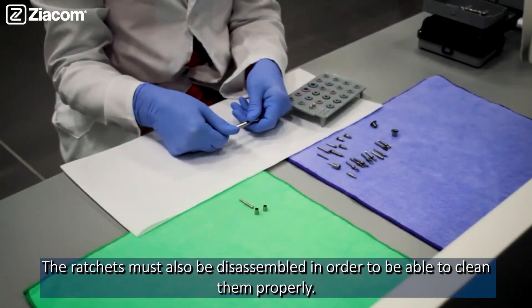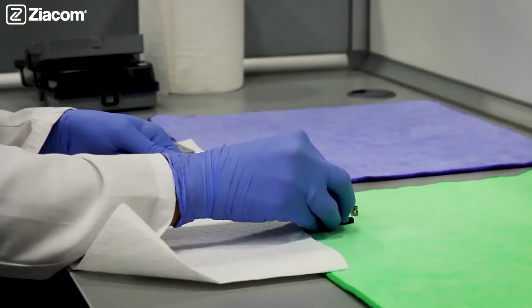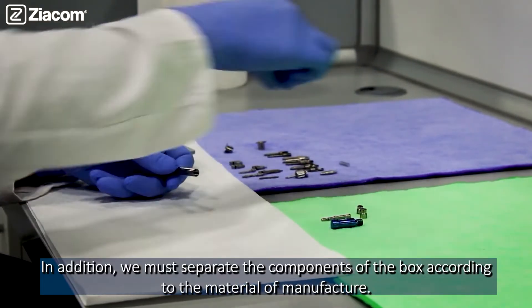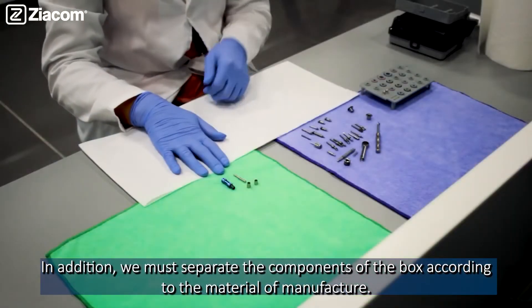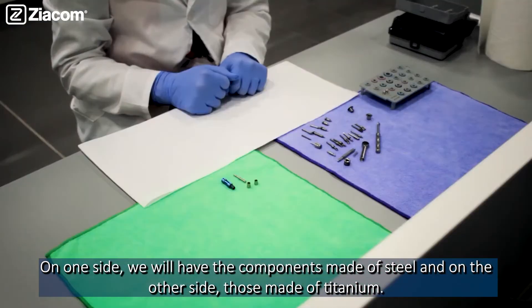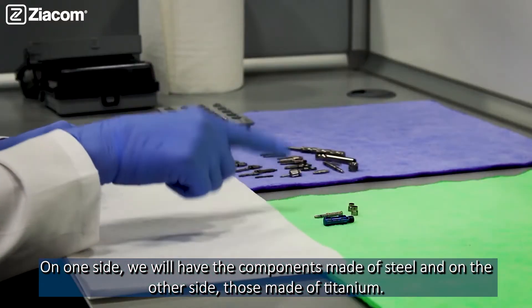The ratchets must also be disassembled in order to be able to clean them properly. In addition, we must separate the components of the box according to the material of manufacture. On one side, we will have the components made of steel, and on the other side, those made of titanium.